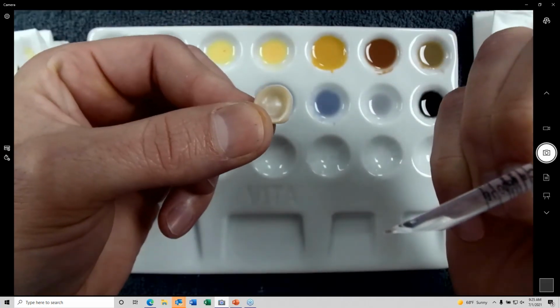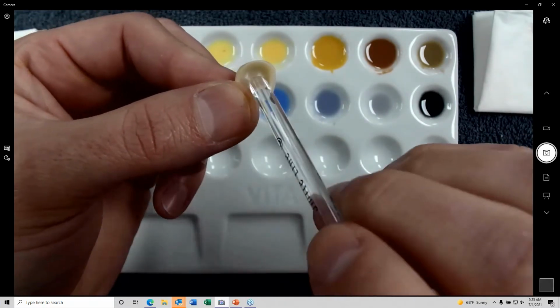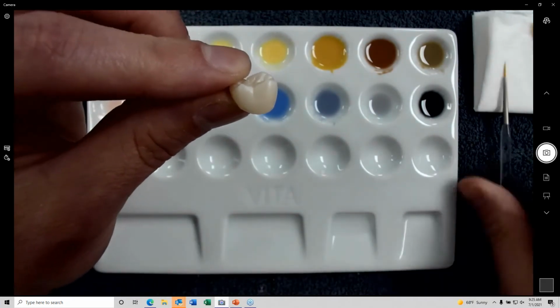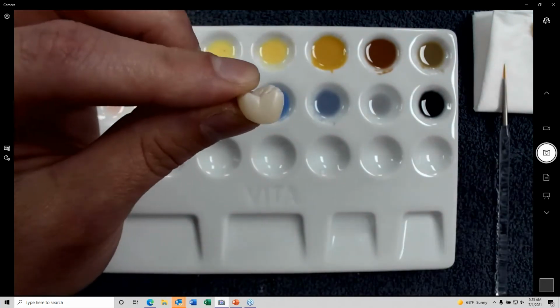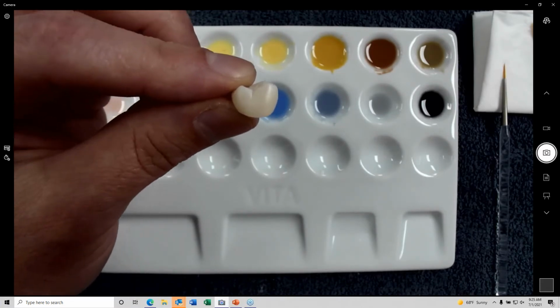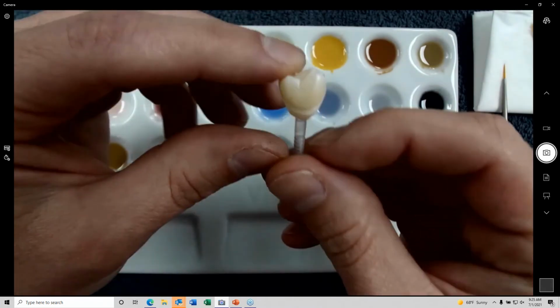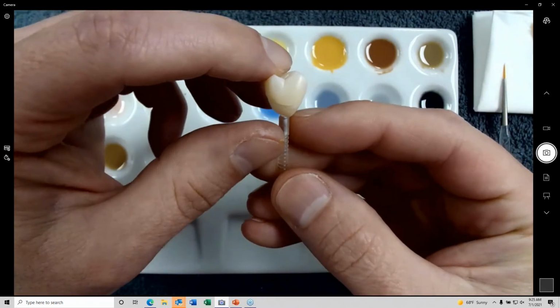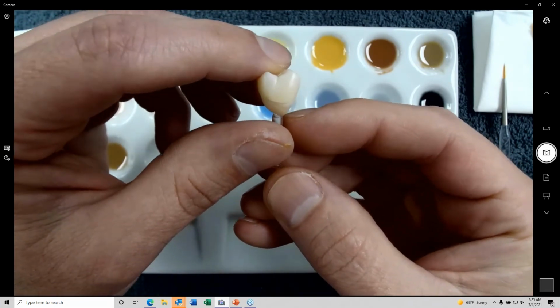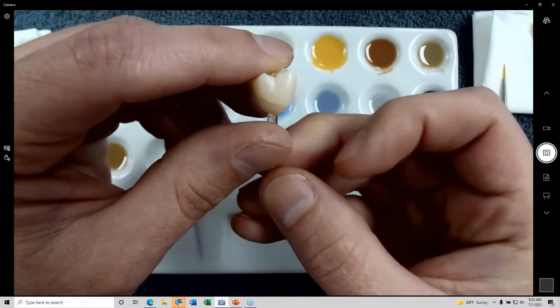And without any kind of a substructure or a core, we've got all this light coming from the inside. So right out of the furnace, your zirconia crown is probably going to look too light compared to your shade tab. What you need to do is add a core to it, and then it will match your shade tab perfectly, because that's going to be representative of what it's going to be like in the mouth.